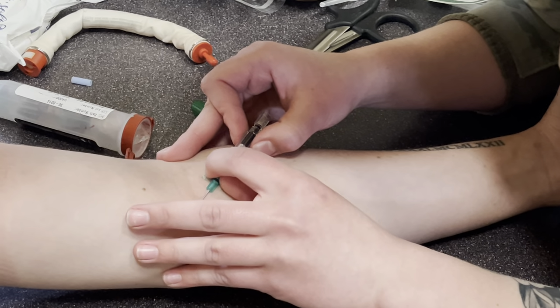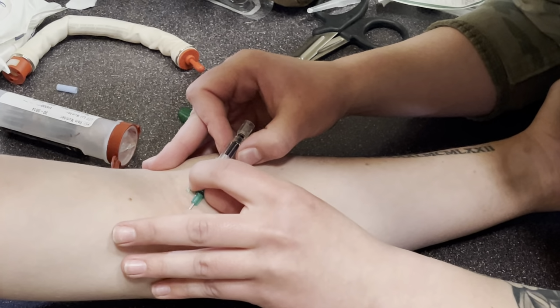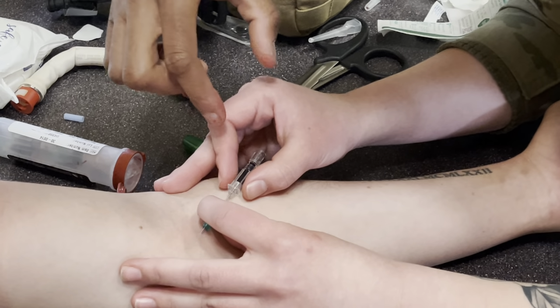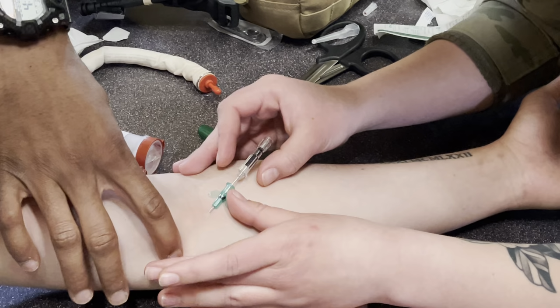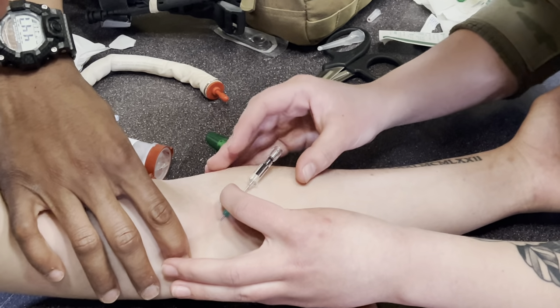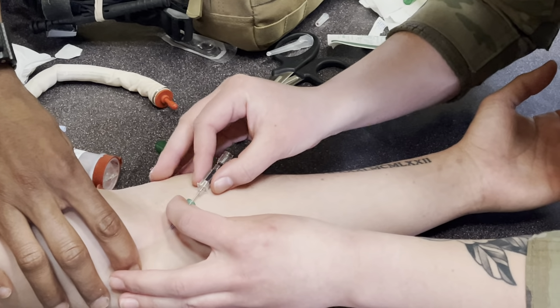If you feel resistance, yeah. And once you, since you're getting ready to take this out, hold pressure kind of around here, just follow the vein and hold pressure. So I'll hold it for you. Okay, take that out. Just pull it through. Yeah, just pull it out.